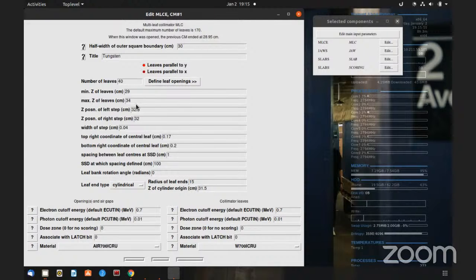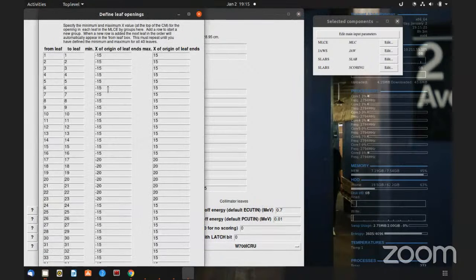So I would calculate. I would say, okay, sir, do I have to use the similar triangle method here? Yes, this is exactly what you have to do, because here you have to put the openings, right? These are the least, and these are the minimum and the maximum openings here. Okay, so that's what you need to do. Similar triangle method here also. Yeah, yeah.